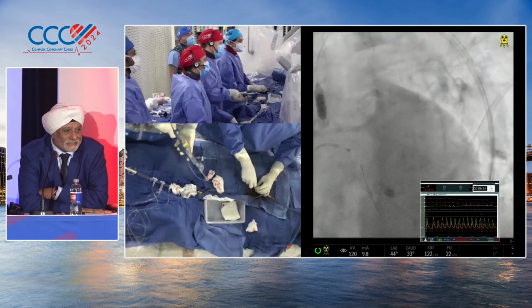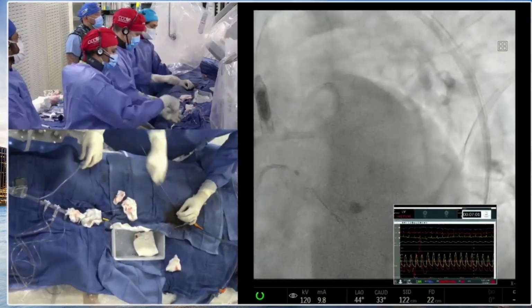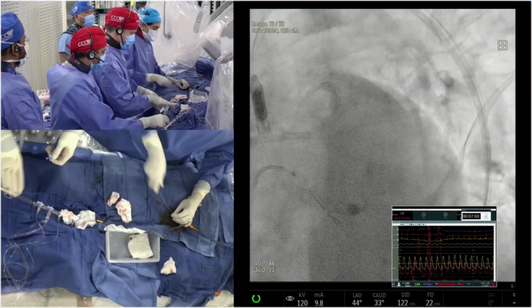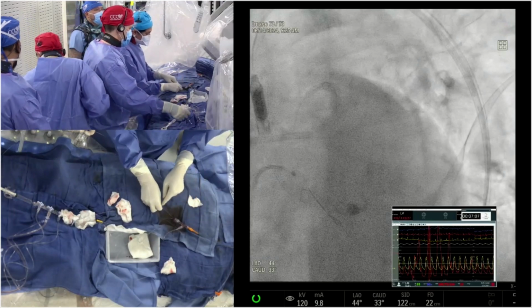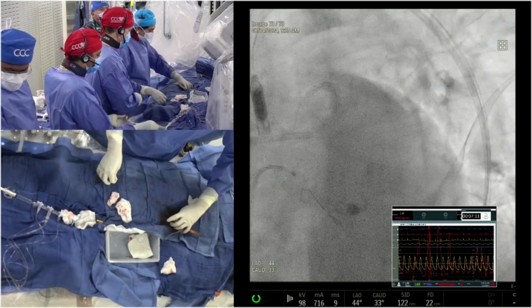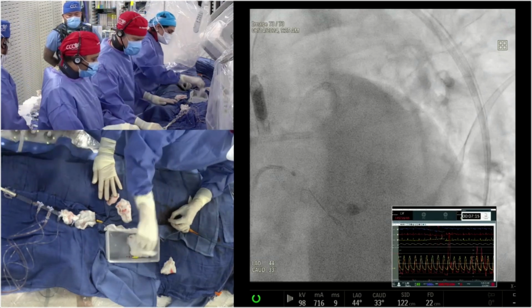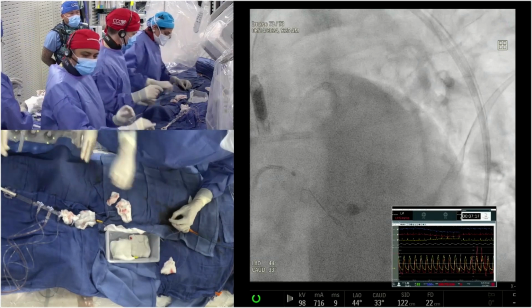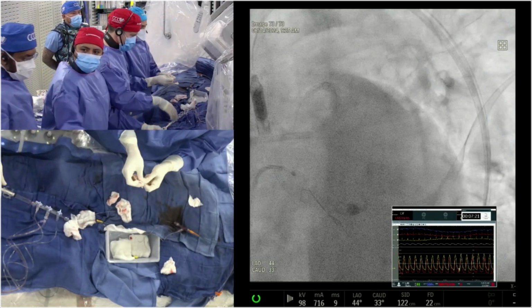Anu, don't be biased. Do what you think. Yeah, exactly. I mean, you should. No, you should. Yeah, believe me, I really think that nodule will give us a problem later on. So I think we do the IVL of that nodule and just do mini crush. And I feel that once we stent it, the circ is going to compromise. Okay. Now, for calcium nodule, for the audience or for the panelists, what works best?